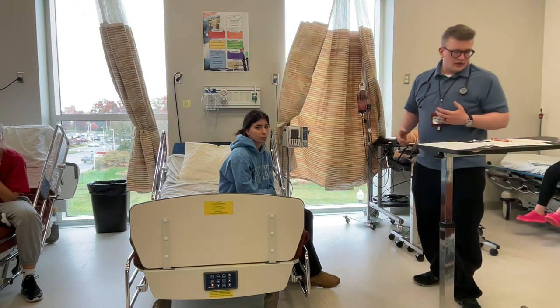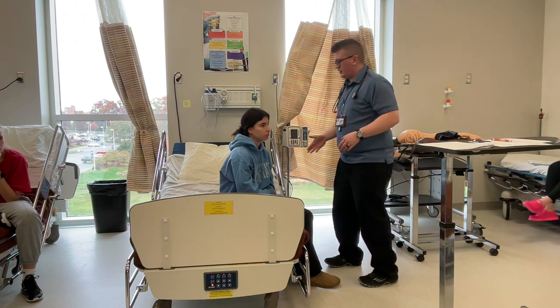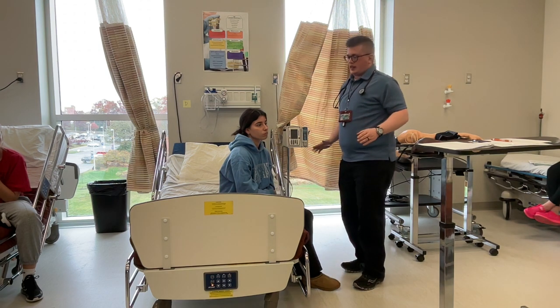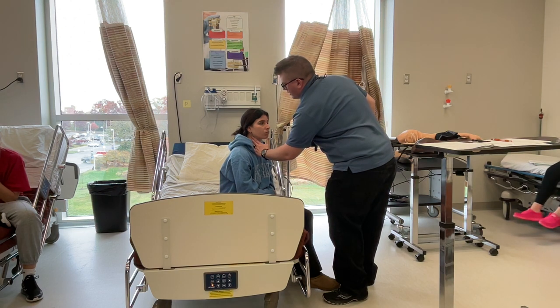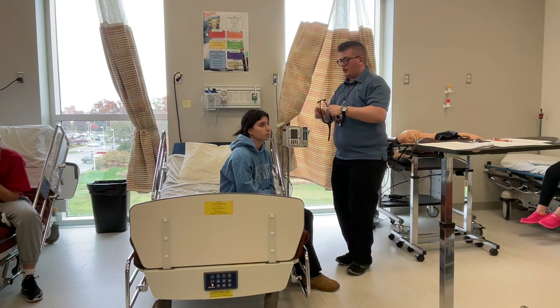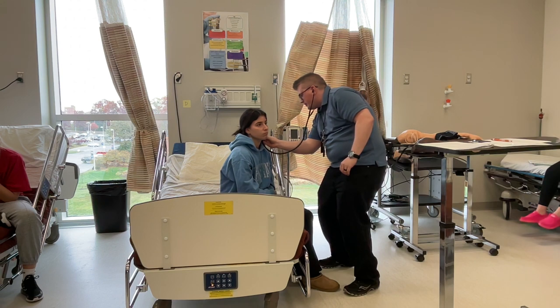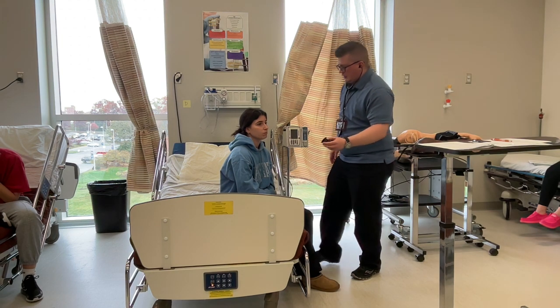So now I'm going to assess your carotid pulse. I'm going to have you breathe normal and easy. And I'm just going to take 2 fingers. And we're never going to do both sides at the same time. I'm going to do the other side. And it's normal. I'm going to have you take a deep breath in and hold it, and I'm going to auscultate for any bruit. And take a few deep breaths then. And hold it.